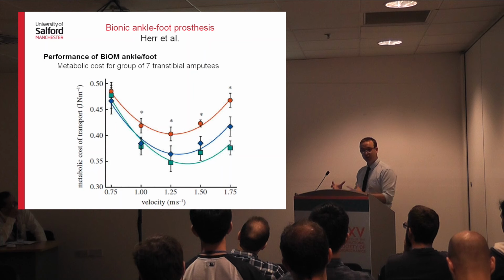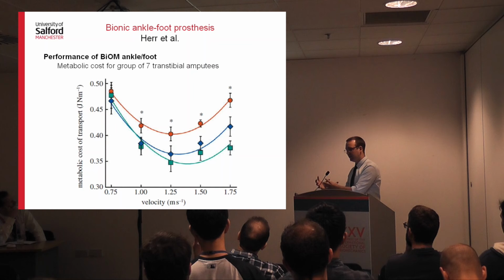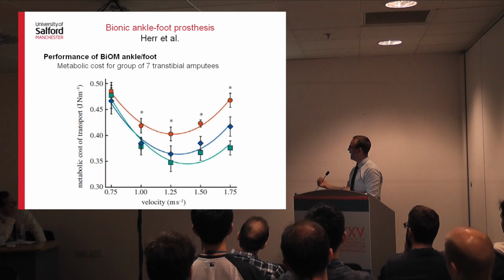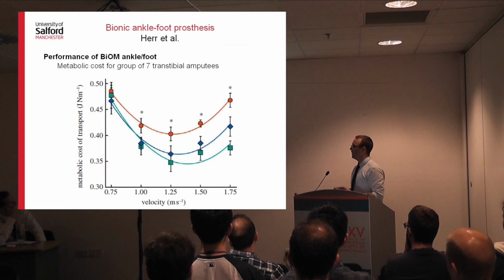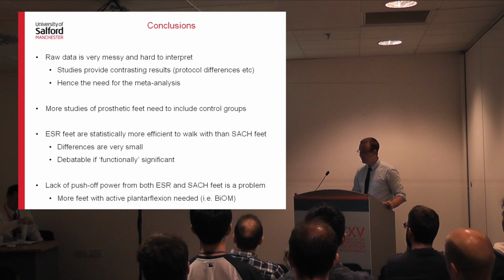So this is really encouraging. This to me says that if we can get amputees and their prosthetic feet producing this push-off power, we have a chance of bringing their cost of walking back in line with the cost of walking of non-amputees. A slight caveat to all this is we have to remember that this is in a controlled environment on a very flat surface, whereas when you send amputees out into the real world, they have very different surfaces and slopes to deal with, but it's at least an encouraging result to start with. So what are the conclusions from the talk?